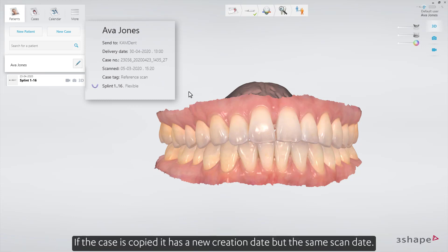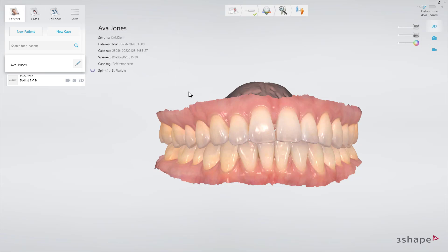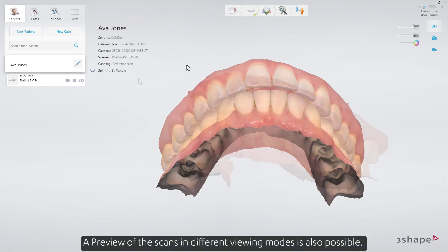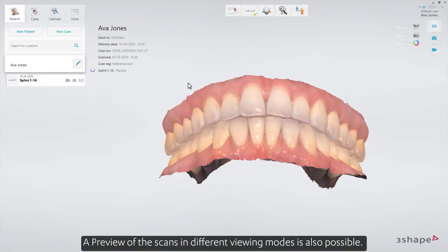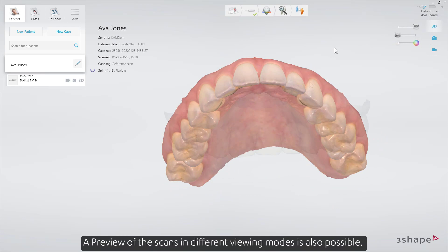If the case is copied, it has a new creation date but the same scan date. If a case tag is added, it is also visible here. A preview of the scans in different viewing modes is also possible.